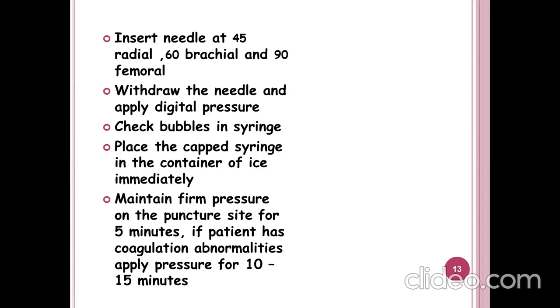Once you collect it, place the capped syringe in the container of ice immediately. Afterwards, maintain firm pressure on the puncture site, the site where you inserted the needle and syringe and got the sample. You have to maintain firm, continuous pressure for 5 minutes.